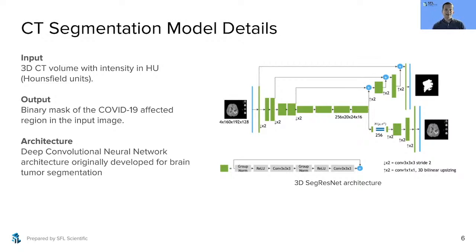It should be noted that this particular architecture also makes use of more advanced features such as autoencoder regularization and skip connections to achieve its results. More broadly, coming up with a model architecture is a time-consuming and empirical process. Academic institutions, research groups, and large organizations make a lot of pre-trained models available for free or as an enticement to use their platform, as is the case with Nvidia Clara.